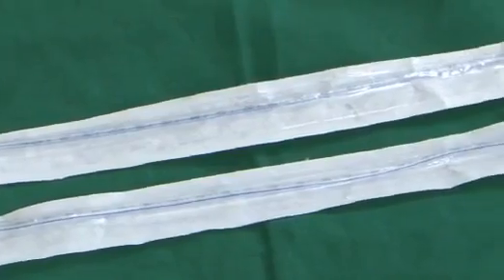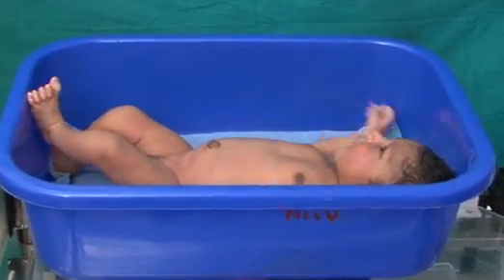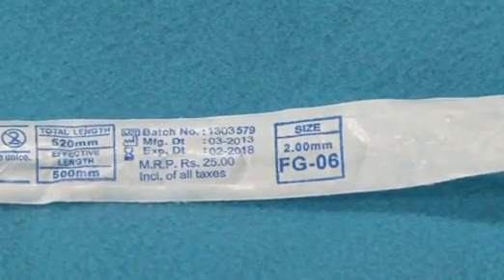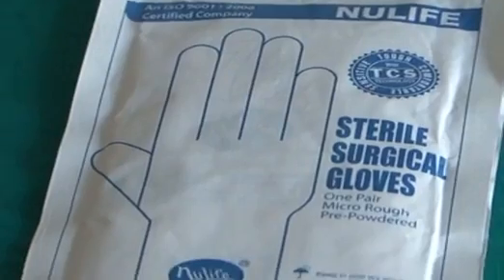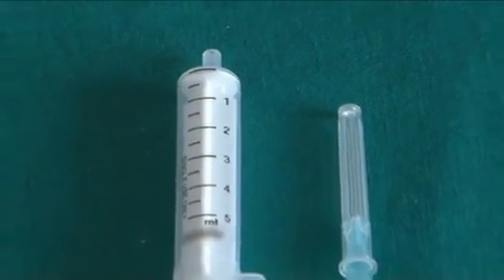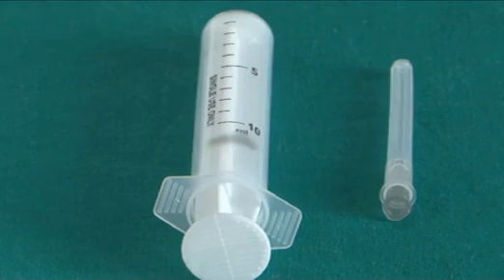Equipment: Feeding tube size 8 French for babies weighing more than 1500 grams, and 6 French for babies weighing less than 1500 grams. Sterile gloves and disposable syringes of 5 ml and 10 ml.